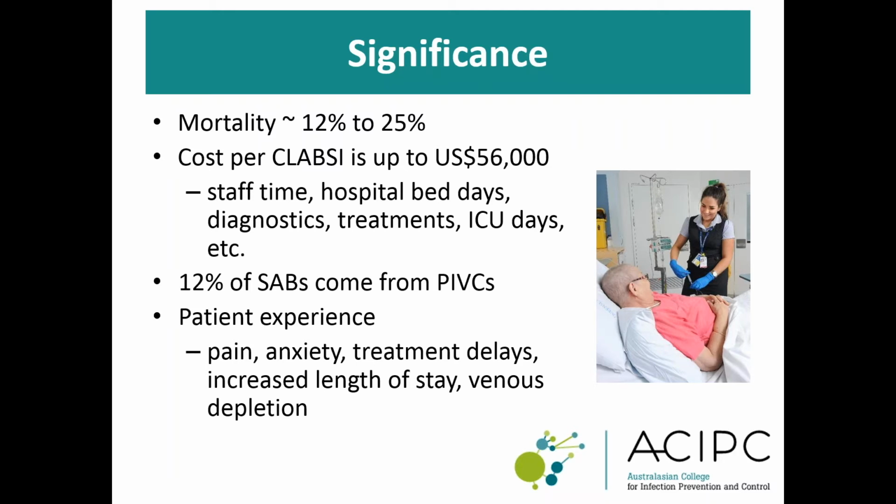We also know that 12% of Staph aureus bacteremias come from peripheral cannulas. And clearly this has an impact on patient experience, pain, anxiety, treatment delays, increased lengths of stay, and eventually venous depletion from having too many needle sticks. So it's a very significant event.